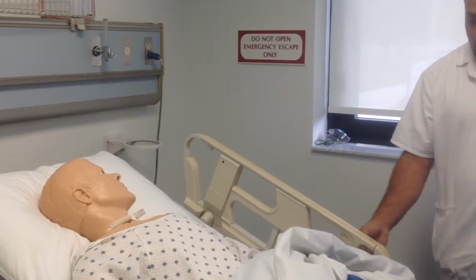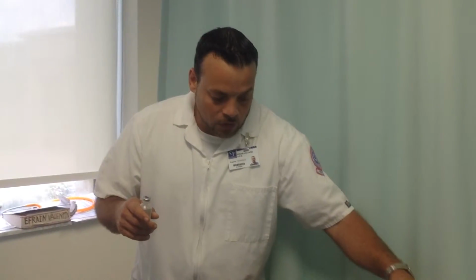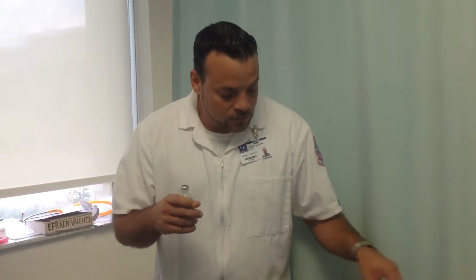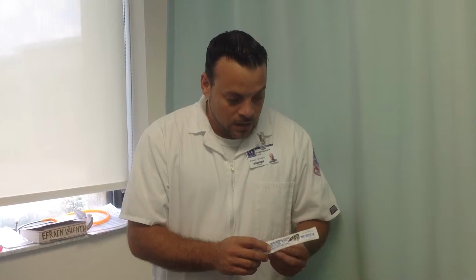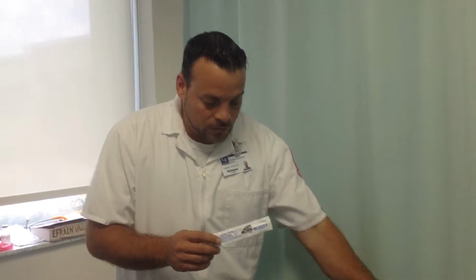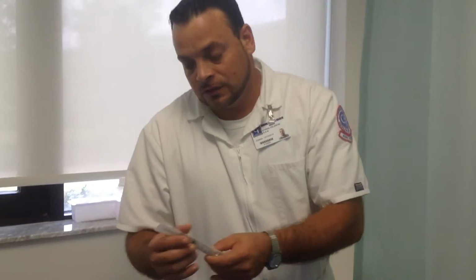Oh, what's that? Well, this medication is an anti-anxiety medication, and it's also used to help sedate you for your pre-op. Okay, for this site that we're going to be using, we're going to use the vastus lateralis.